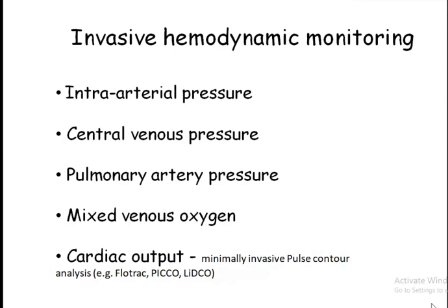And this is the invasive hemodynamic monitoring. So what all comes under invasive hemodynamic monitoring? Although this is a very vast topic and cannot be completely covered in a single lecture, I have tried to compile it so that I can give you a basic idea of all these parameters.